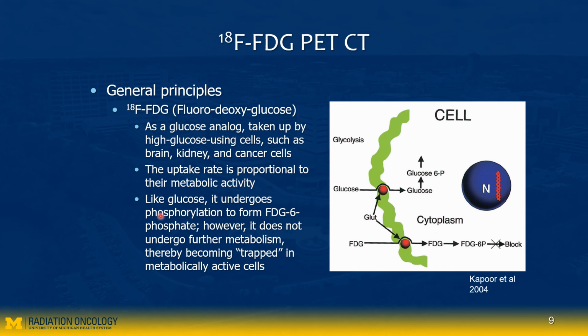Okay, so I'm not going to go into detail because I don't claim to be an expert in this mechanism, but you can simply understand this. The FDG goes into the patient's cells, and then it gets trapped inside the cell, not like any other glucose. This FDG glucose gets trapped inside the cell, and then it emits a positron that I will explain later, and then we detect the annihilation photon from that positron and electron.